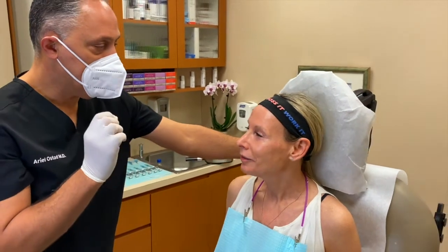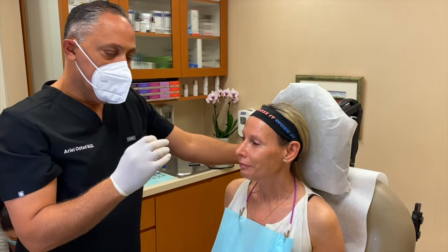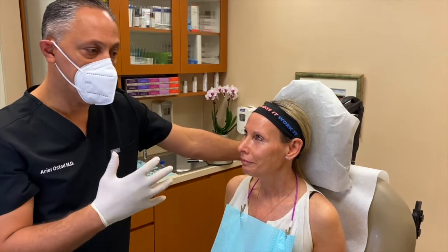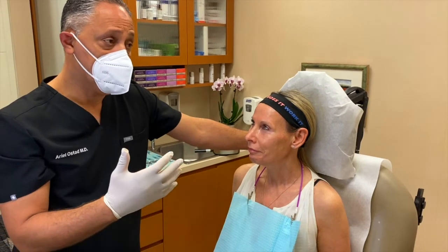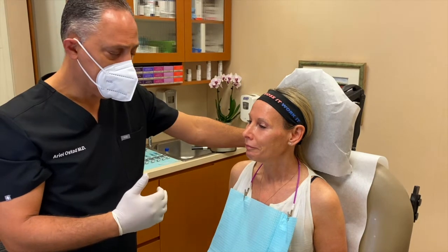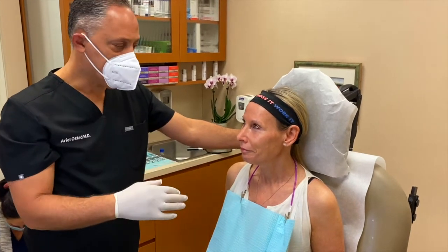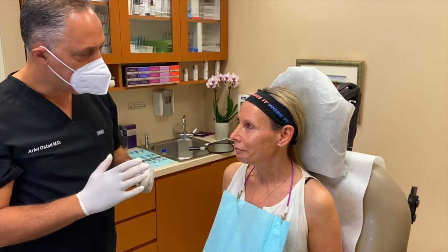One of the things I also wanted to pass along is that by using needles, you can cause a lot of bruising. My patients come here, they're all active, they're all working, they're all social. One of the things they have said to me is, I want to make sure I don't get bruised, because maybe they've had experiences elsewhere where they've had bruising. So I like to use cannulas. Cannulas are blunt instruments. They're shaped like a needle, they're extremely thin. You'll see me use them. They really minimize the risk of bruising because they're absolutely dull.